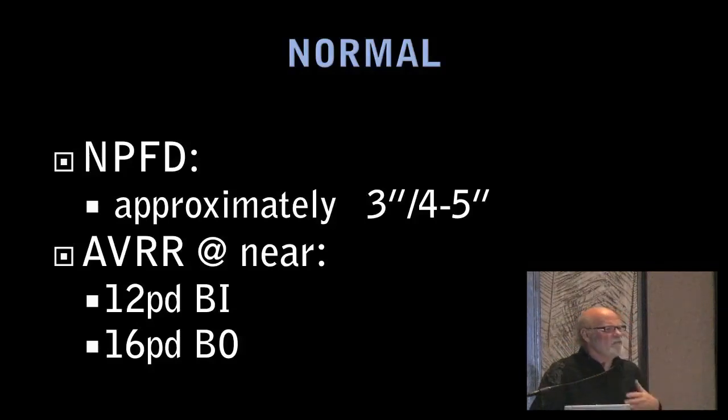How do I know? Vigilance. Testing everyone. It's so quick. But what I do is, on divergence with a 12 prism base in limit, I stop at about 8 and say, hey, is it still aligned? Is it still clear? To recapture arousal and attention as they get near their limits. And I do the same thing for the base out at about 12. So I stop for a second and recalibrate their attentional arousal to make sure they're on target.